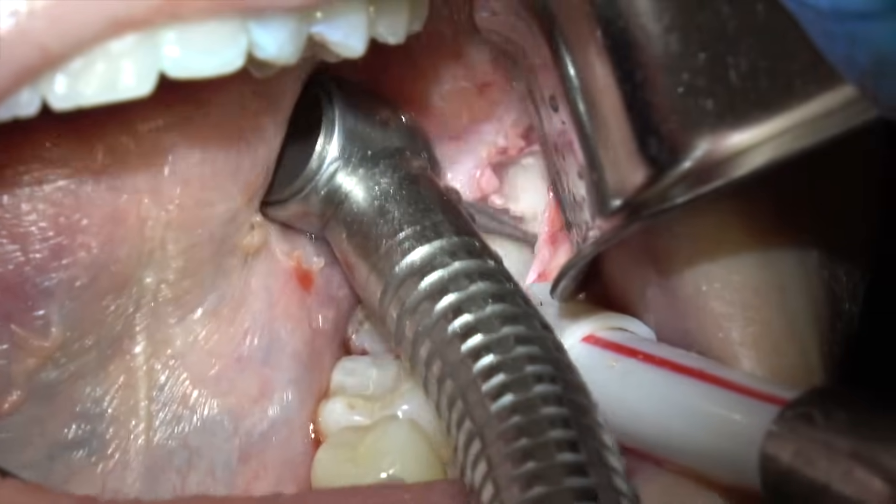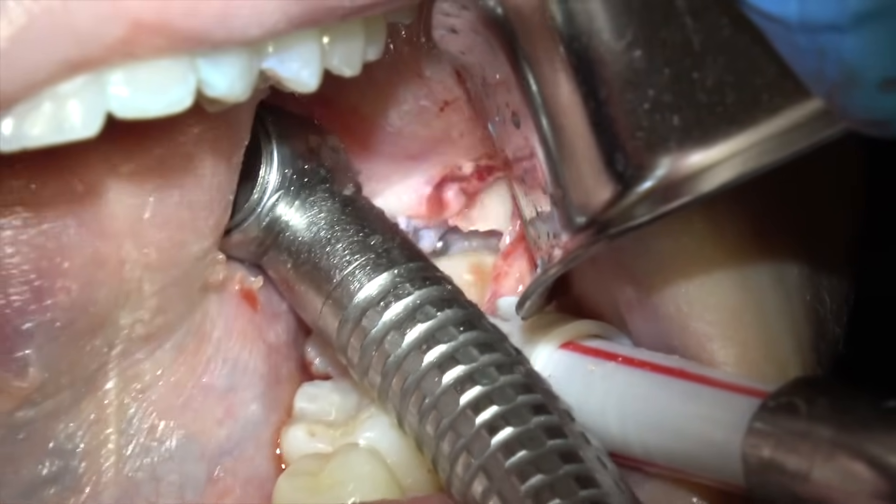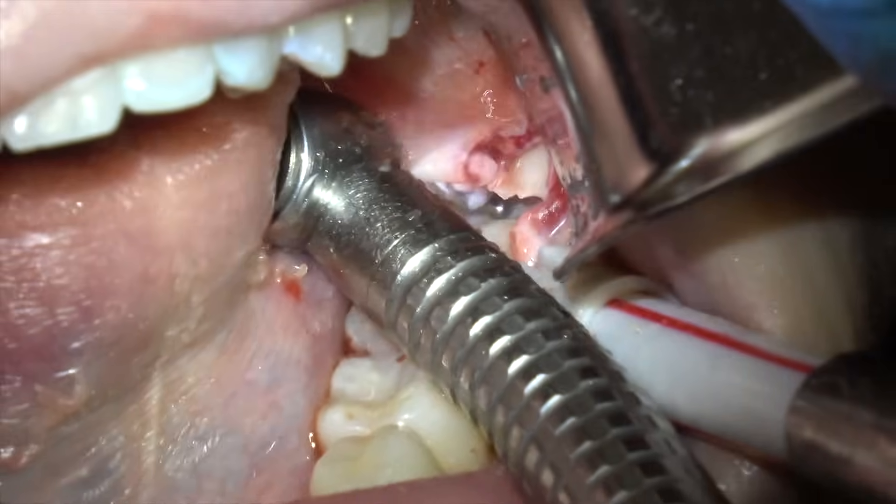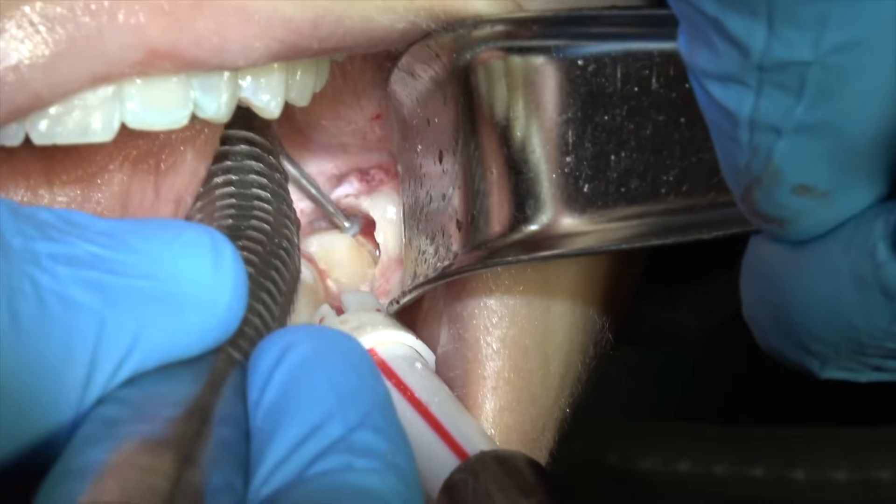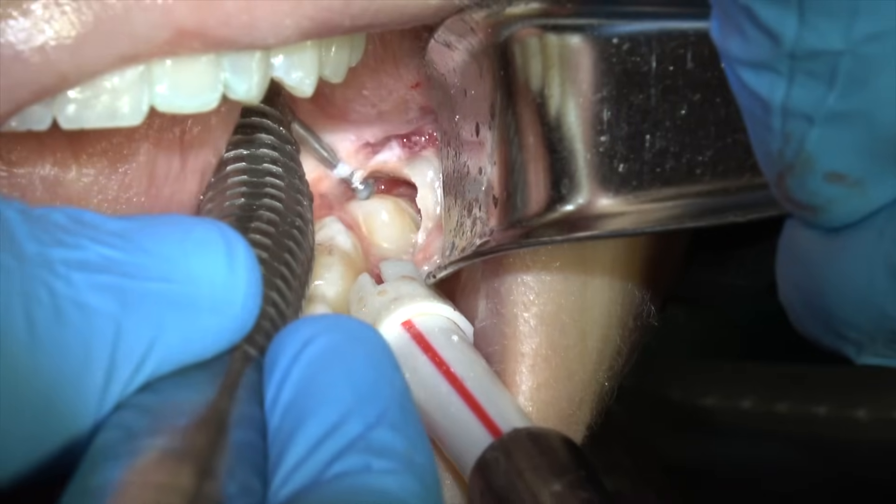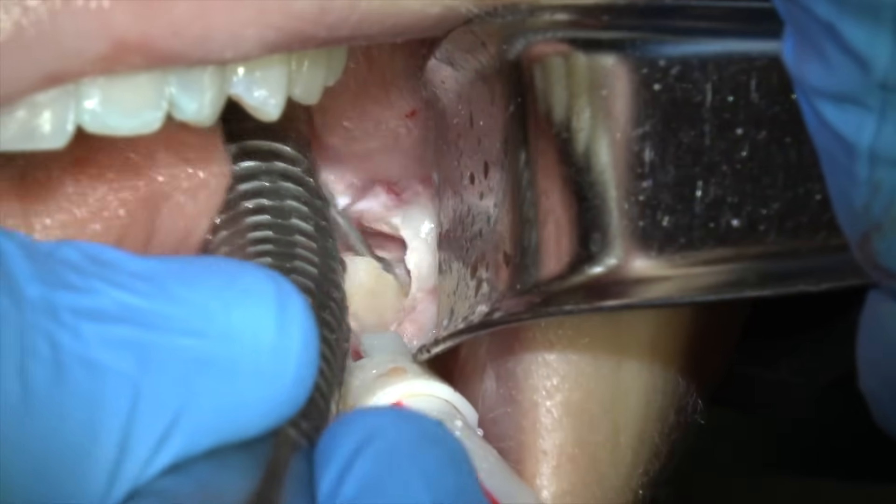Because you've got to have a little space to elevate the distal portion of that tooth. If you don't have any space, you can't elevate it when it's angled forward like that tooth is. But this is why you've got to reflect a pretty good flap. So you can see how the tooth is angled directly into the distal of the second molar. But you've got to create a little space.